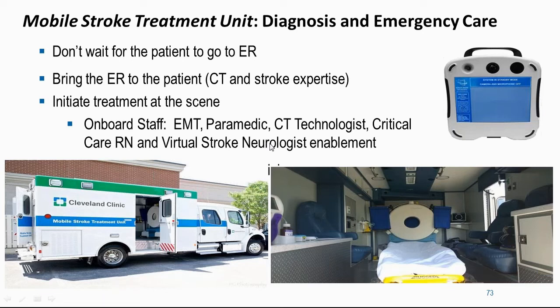to the patient. And at one end, we have a portable scanner from Neurologica. We've already had 2 of these in our intensive care units at the main hospital campus.